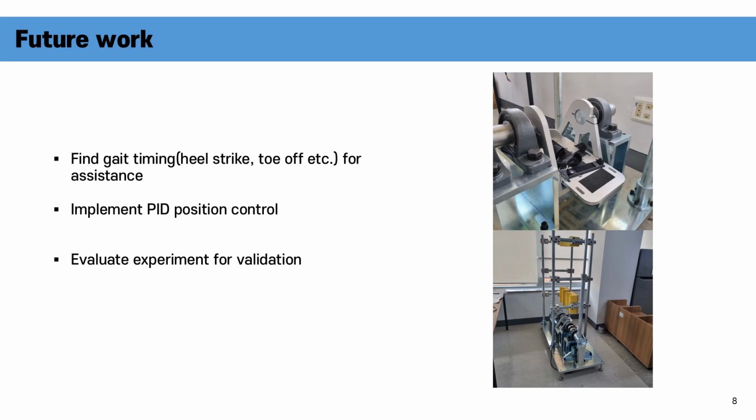About the control process, because we made the trajectory only for plantarflexion motion, we need to make a trajectory for the dorsiflexion motors. Also, the force value will be used for feedback control using load cell sensors. After that, we will do an experiment using an apparatus and measure the rotation angle to validate our system.